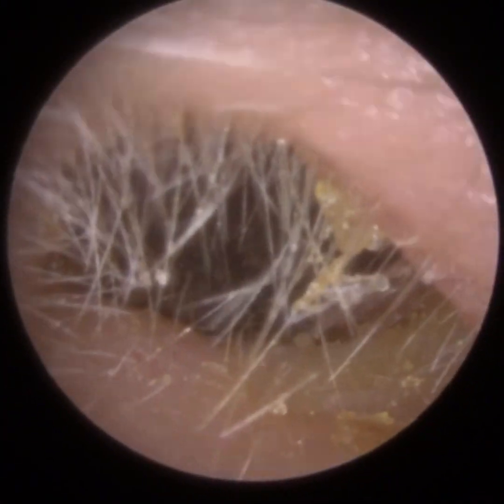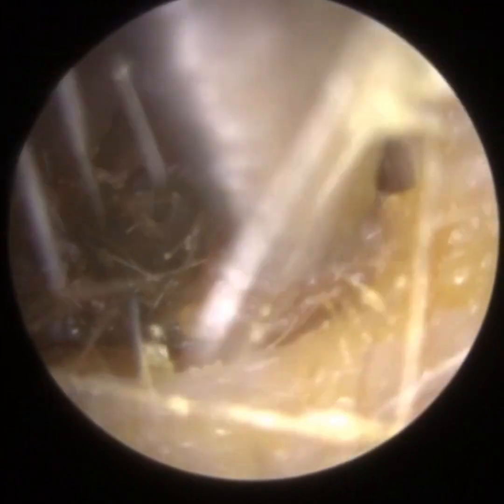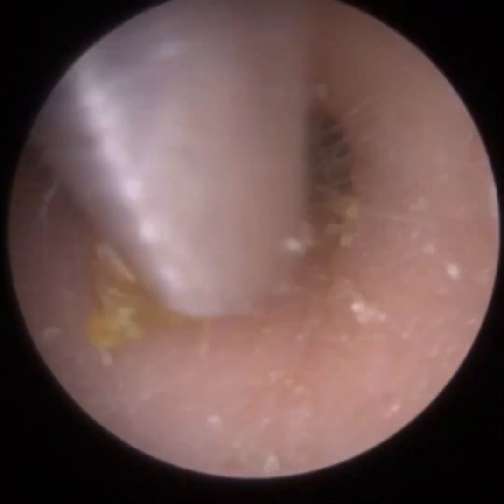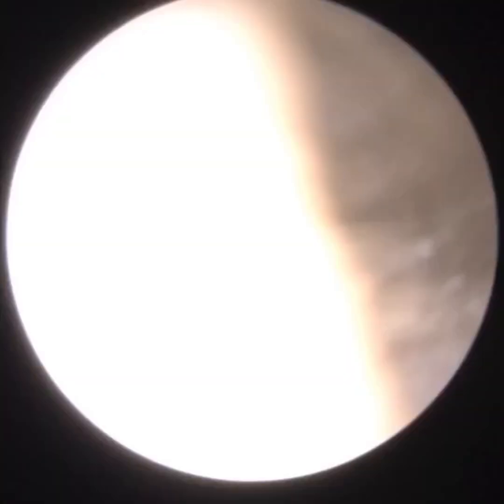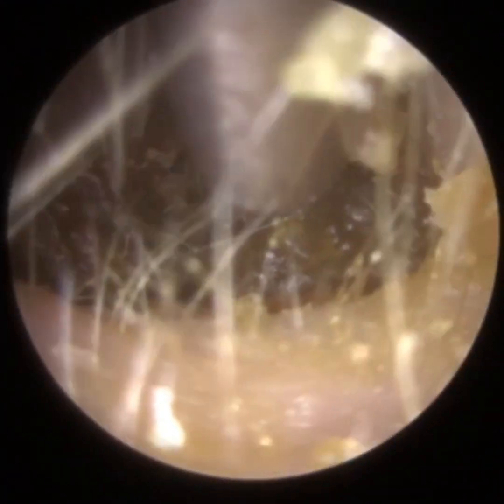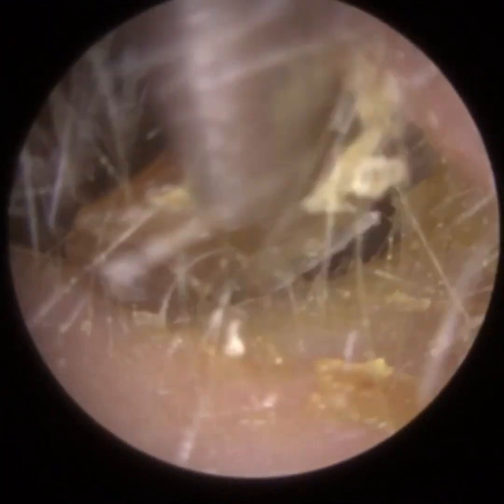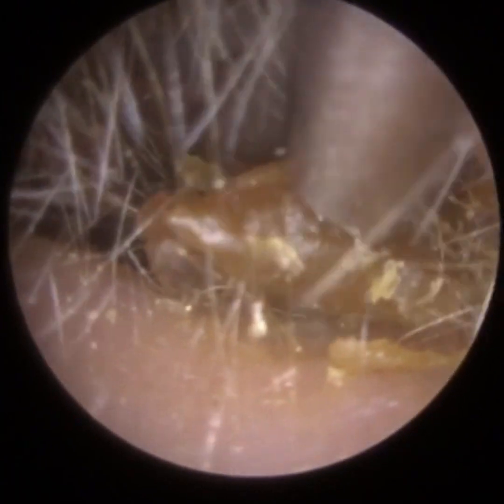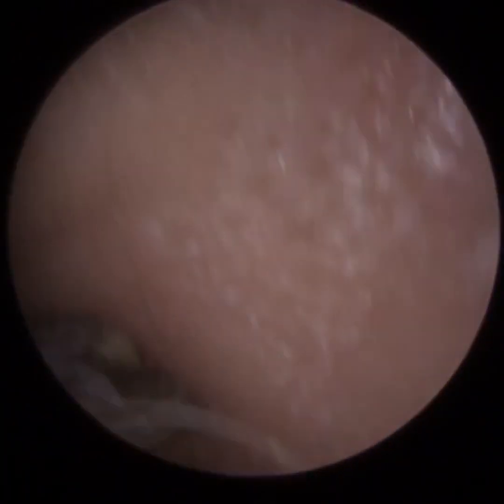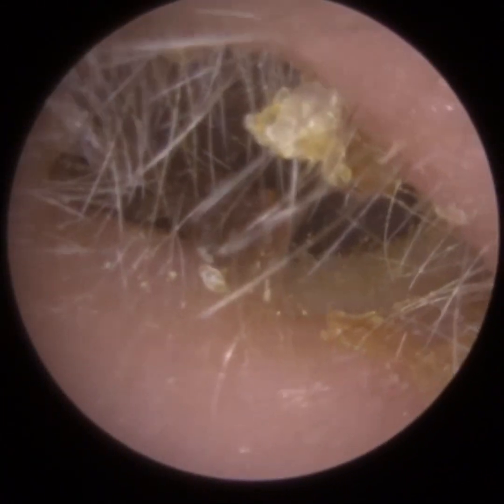On to the left ear now — you can see quite a few cilia at the entrance. There is quite a lot of dry earwax here as well, but it's not as occluding as the original right ear. In the right ear, some of the dry wax was really lodged immediately against the eardrum, whereas this is more lateral — some near the entrance and mid-canal.